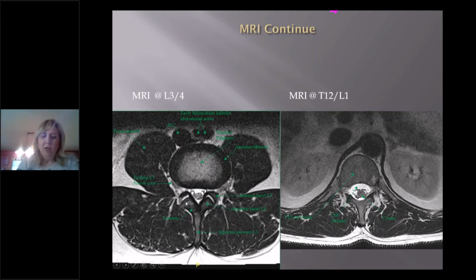This is a facet joint. We got a little bit of fluid in the facet joint, which is pretty normal. All of this muscle out here, from this little white thing over, is multifidus and then longissimus. So you got two big muscle groups coming down through there. We see the psoas muscle, this big guy up here, and you got the other one here, big psoas muscle. We see the nerve roots as they exit here, the other one over here.